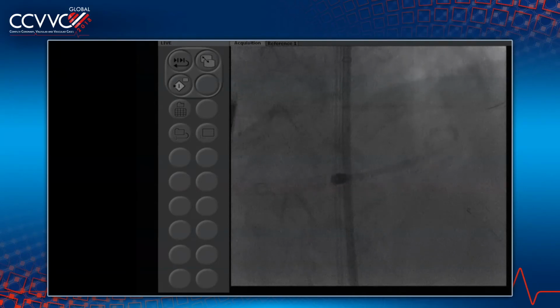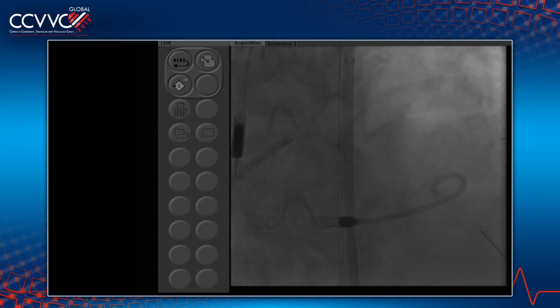That's pretty big, and the FFR, you said, maybe you should do the FFR again. It changes. Yeah, I think after you open this lesion in the diag, I would. No, why would we FFR the LAD after opening the diag? When you're going across, I mean, are you planning to stent? You're stenting across with a dual stent across, right? To me, I don't know where you're seeing the issue of the lesion. Is the lesion in the LAD or in the ostium of the diagonal? No, it is in the LAD. Based on the FFR, it is the LAD.